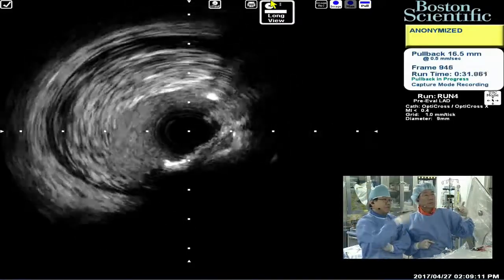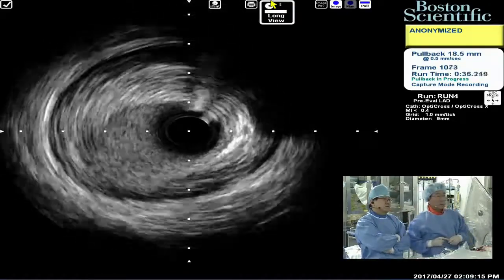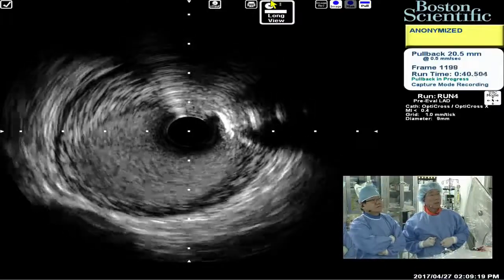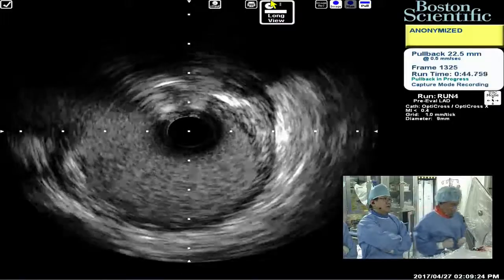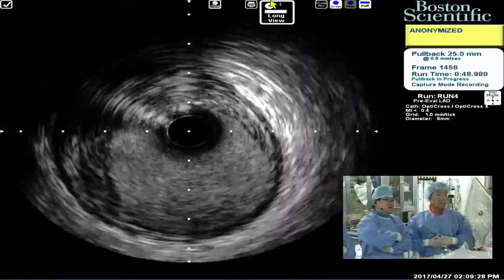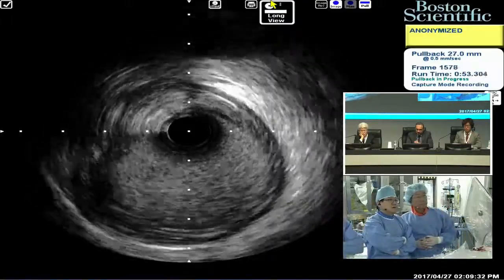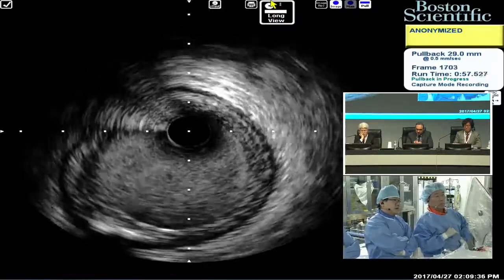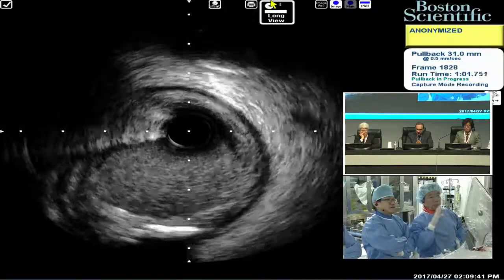Diagonal branch from one of them. All right. Did you pass? Yes, I did. I pick up. This is proximal LAD. For the minimal plaque, internal diameter is almost 3.5. Very mild disease. Reference vessel diameter is very big, 4.